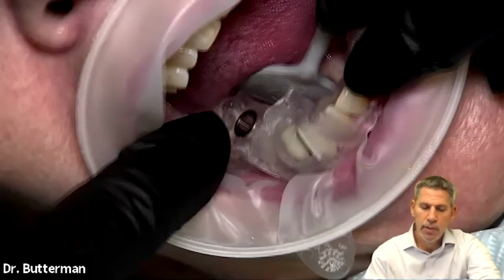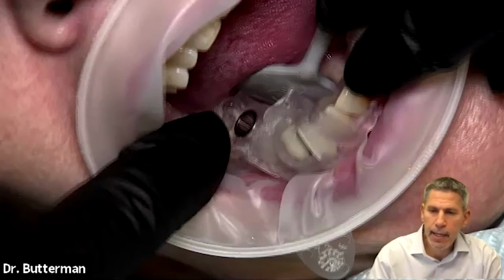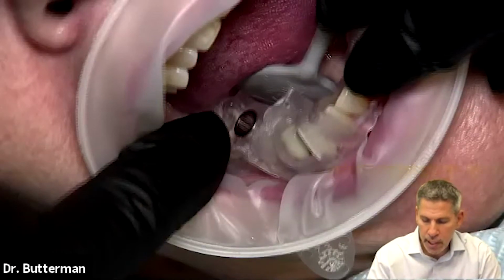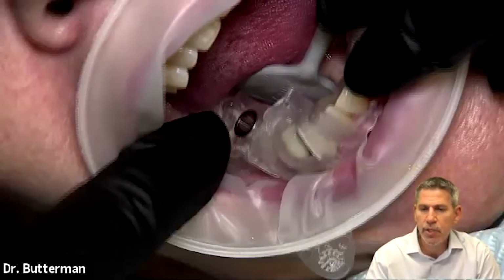So let's do a little surgery. This is the case that I just planned and designed. And I sped this up. Don't worry, you won't have to sit through a long surgery. I wish I was this fast, but let me just run it through.